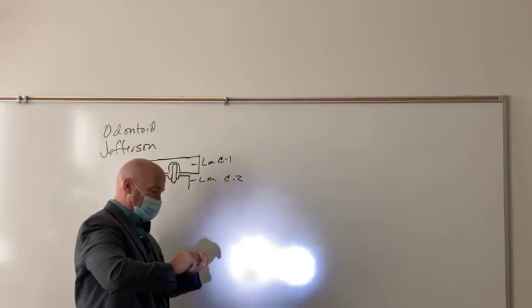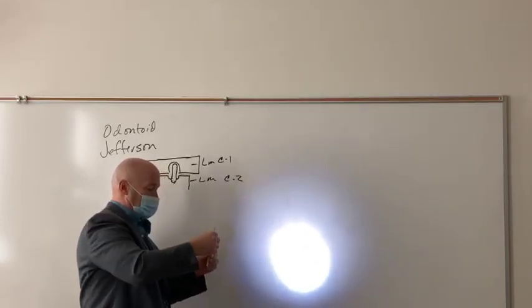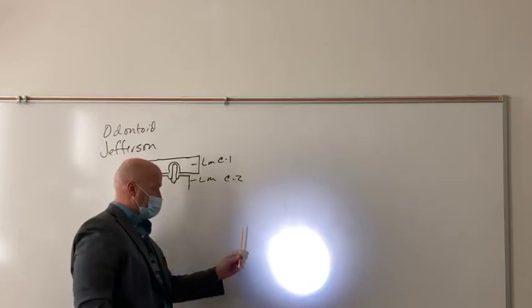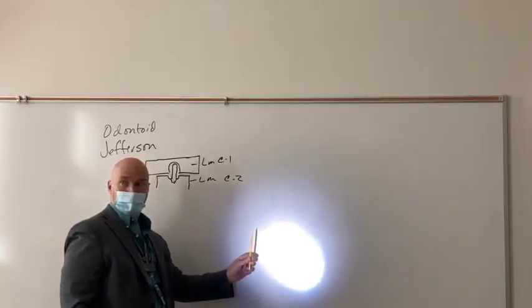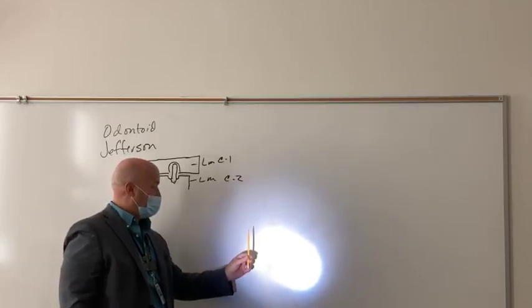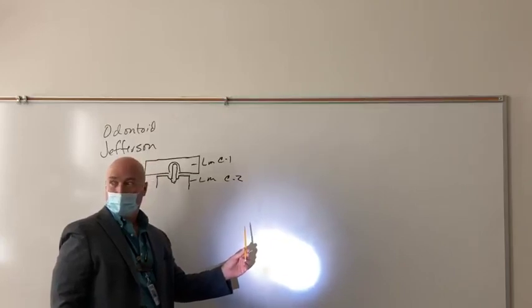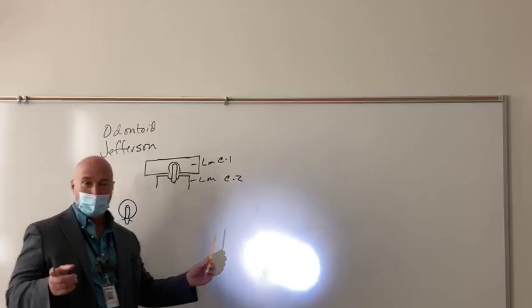So, if we've got a perpendicular relationship between the central ray and the anatomy, can you see the fracture? Yeah, you can, can't you? If though, we've got an angulation, can you see it quite so well? No, you can't. So you got a number of different things going on here.